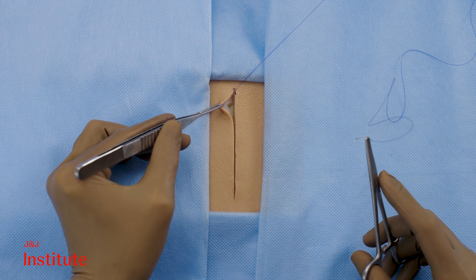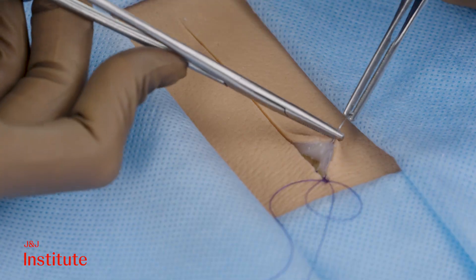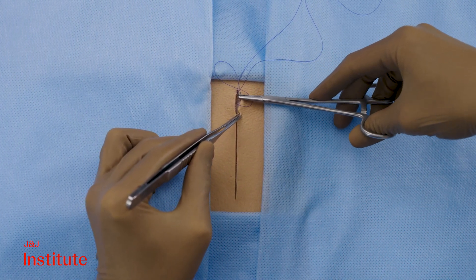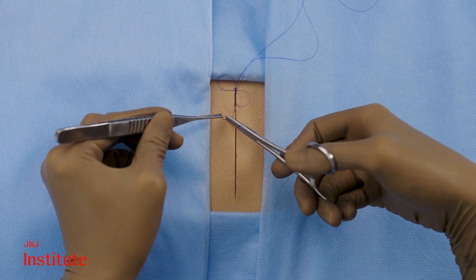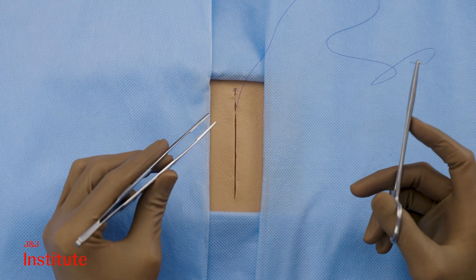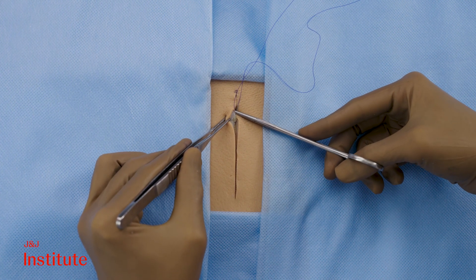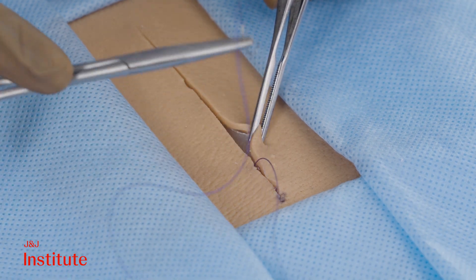Using forceps, retract the skin edge to take another bite in the subcuticular plane. Proper needle placement within the dermis should provide some resistance. If the needle passes too deep through tissues within the subcutaneous plane, no resistance will be felt. Take this as a cue to reposition nearby.